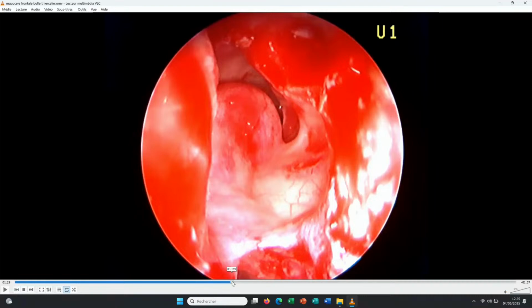We are going to finish the video from yesterday concerning this mucocele. I don't know if you remember that it was a congenital mucocele of the right frontal sinus, and we started at the end of the day to show this video. And you have here the mucocele.